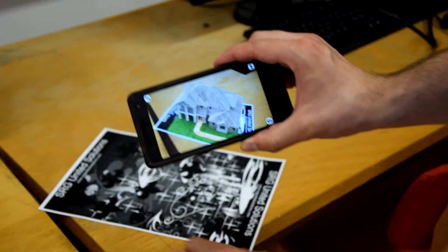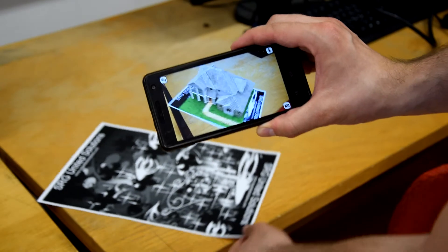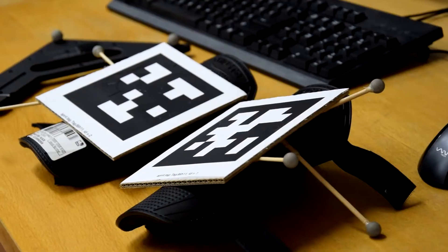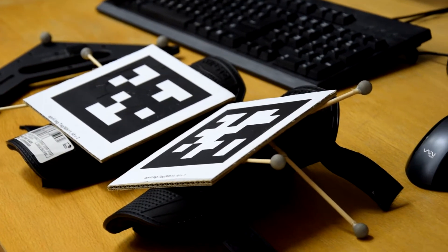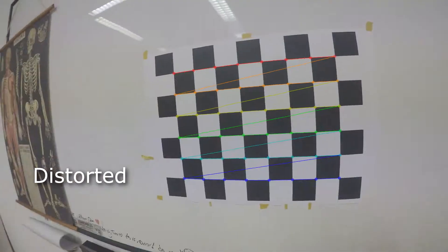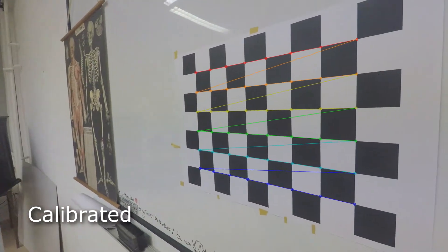Our proposed method uses augmented reality markers to track body segments with a single action camera. First, the optical distortions have to be compensated through camera calibration.